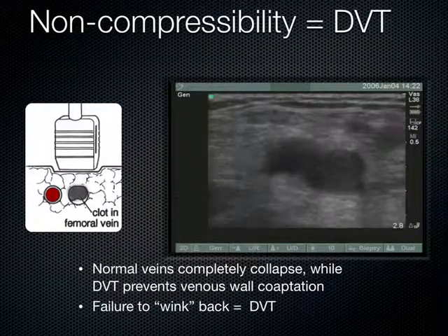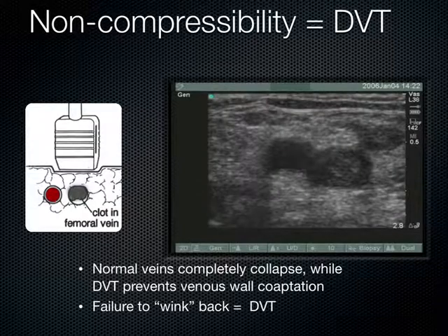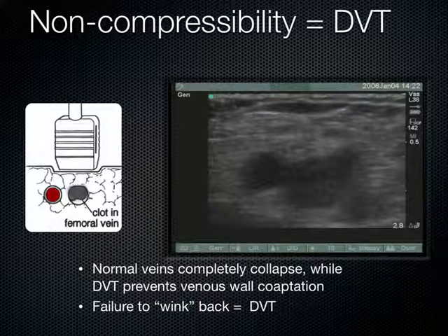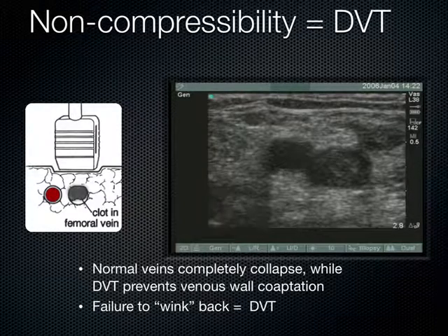Capture that on video and show somebody without having to keep compressing it, because the more you compress these clots, the more likelihood of dislodging a DVT and becoming a pulmonary embolism, which is not a good thing, obviously.